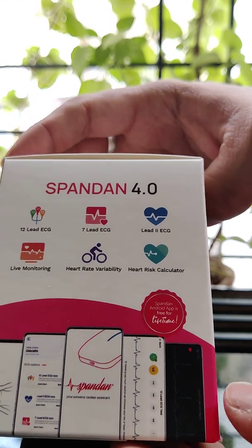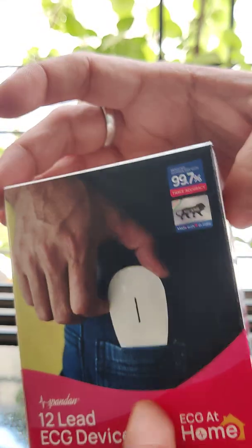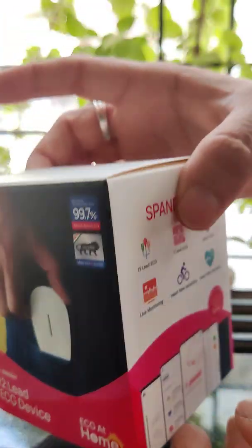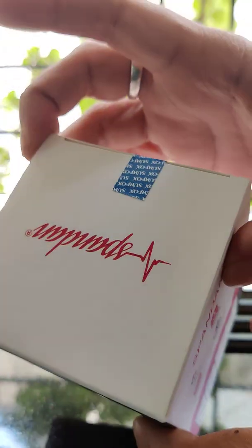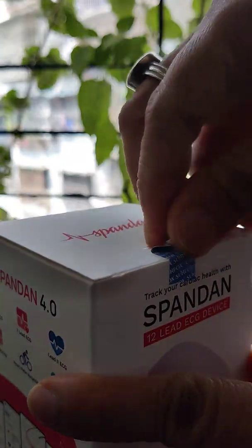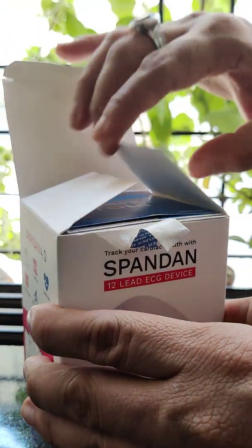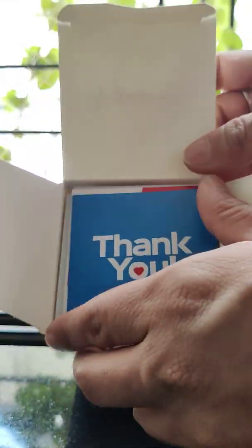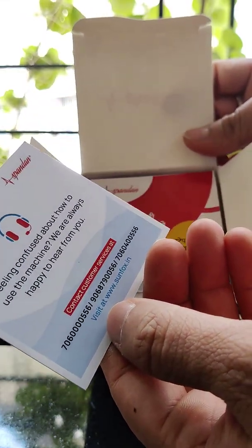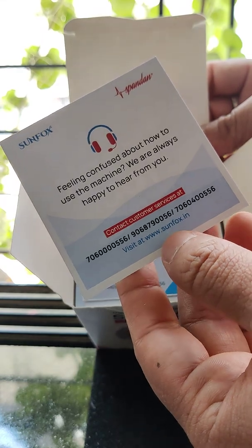This was the quick unboxing of the Spandan 12-lead ECG device, which is a homegrown product entirely based and created out of India. It's very small and very light. Let me open the box and see the actual device itself. Inside we have a thank you card — a letter of thanks from the founders — which also mentions where you can connect if you want to know more about how to use the machine.